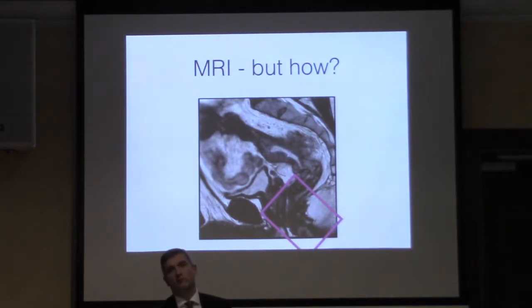Bearing in mind that no one's rectum is the same, so they can't just say, well, I'll do those in those 3 planes. They need to see the sagittal on the long axis of the rectum, however it lies, and then acquire images at that level.